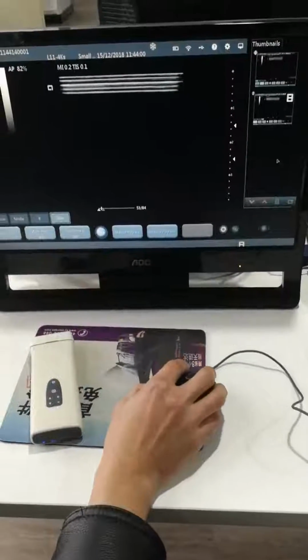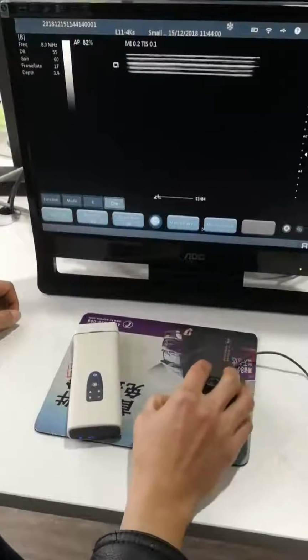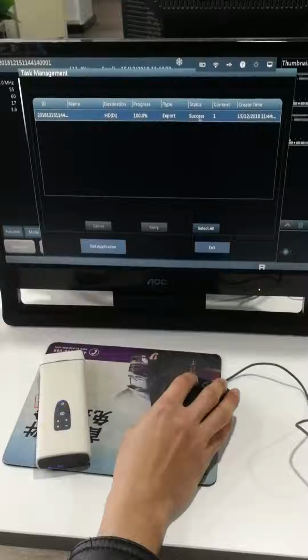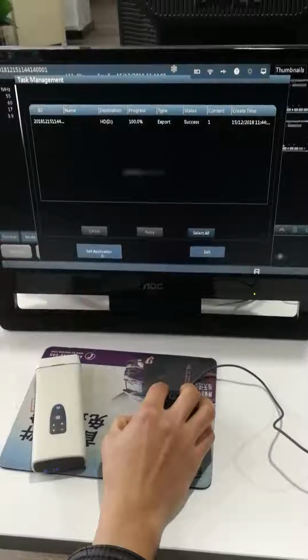You can also export the images to your local disk and click OK, and then you will see here it's exported successfully. If you finish the exam, you can just exit the application.